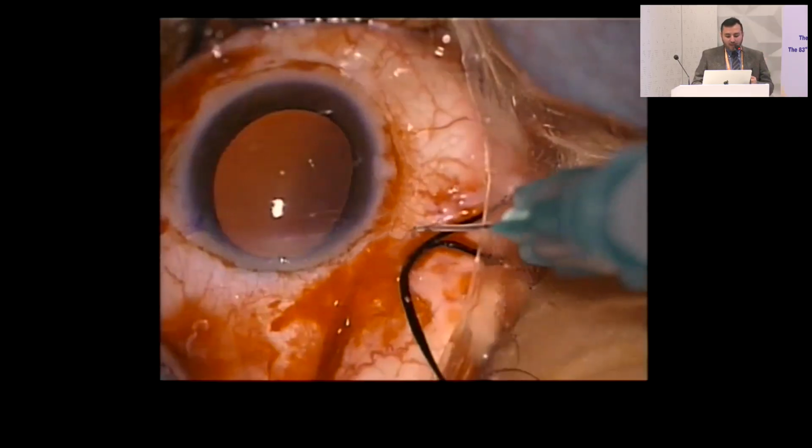And this is the strongest point in treating the posterior staphyloma in myopic traction maculopathy: conforming the posterior pole configuration by using the macular buckle.